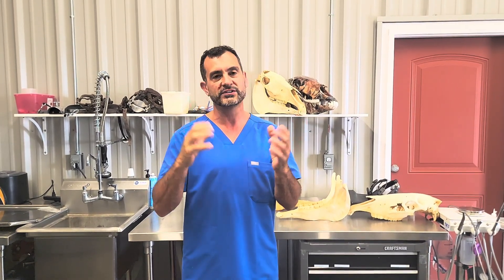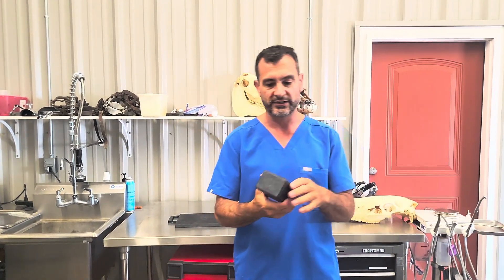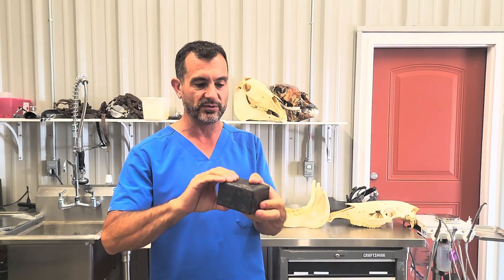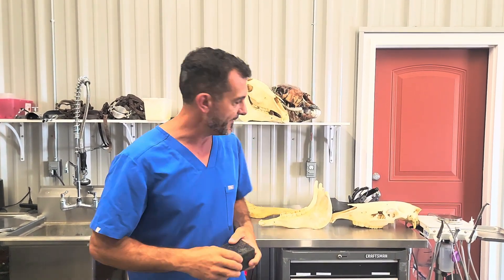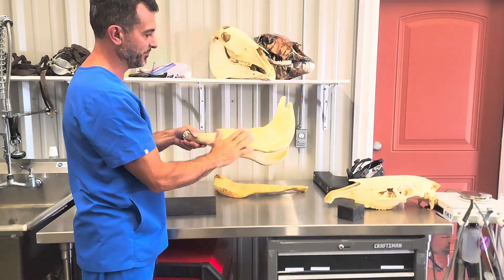The most important principle is you always want to use a block to keep the mouth open. That applies to any x-rays of the teeth — you should never really do dental radiographs without a block in the mouth. If you're not using one, you're not able to isolate structures very well and the quality of your radiographs is already limited by a pretty big percentage. You want to put something between the incisors — you can use any block of wood.